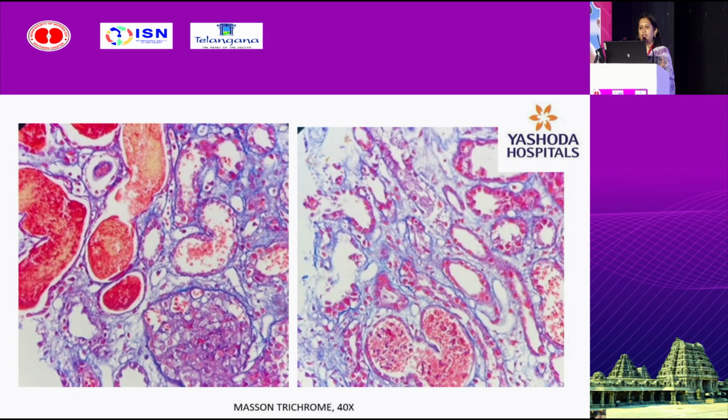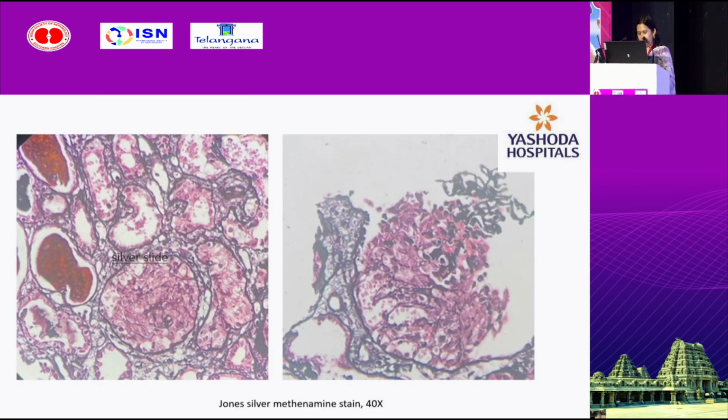And these are the lining cells. The cytoplasm is staining red, overlying the blue nucleus, hence you're seeing the red color of the cells lining the tubules. And these are the RBC casts. Silver stain will enable us to appreciate the destroyed tuft. Here the tuft is fragmented, here we see a portion of the tuft, and here again a tiny portion of the tuft.